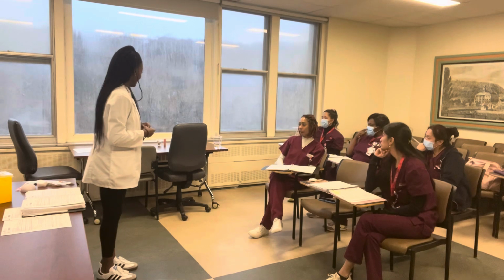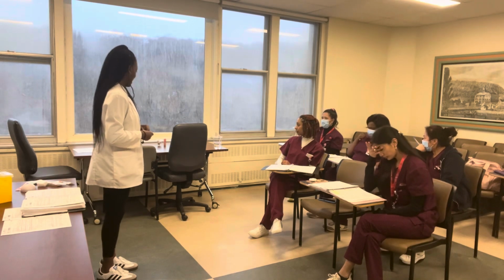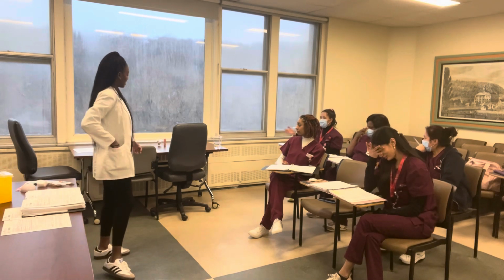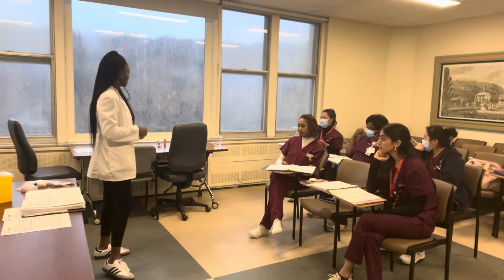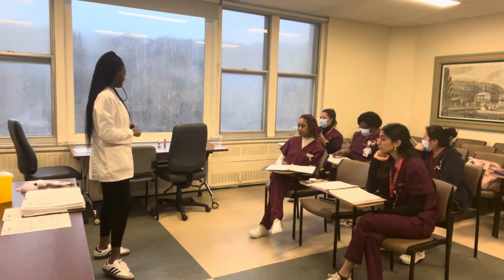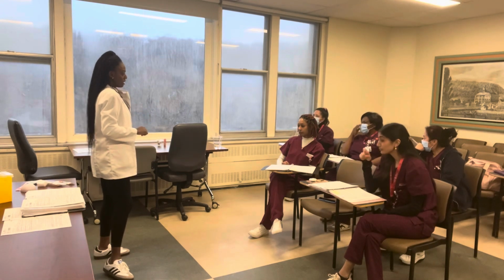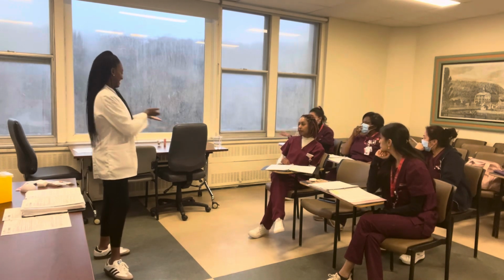That would be great for you, so you know how to do that. Me, I did insulin, but it was the insulin pen, and I find it more convenient, much safer. Because for me, if you do the manual insulin thing, there's room for medication error. There can still be room for error in both. For the pen, yes, I would say, but that depends on the sliding scale. If you're not reading it properly, then it's the same thing.